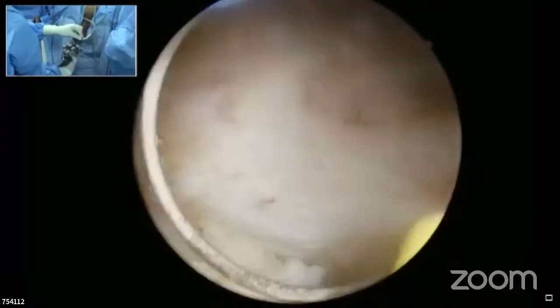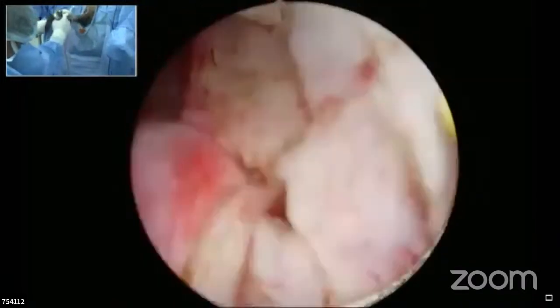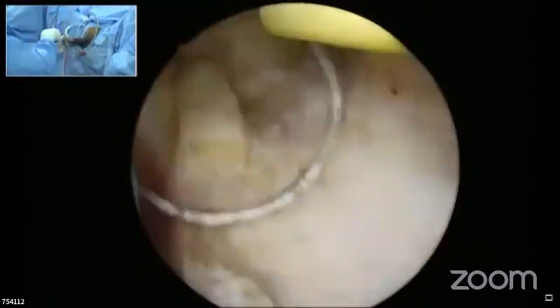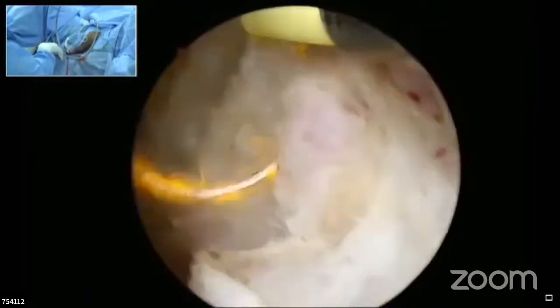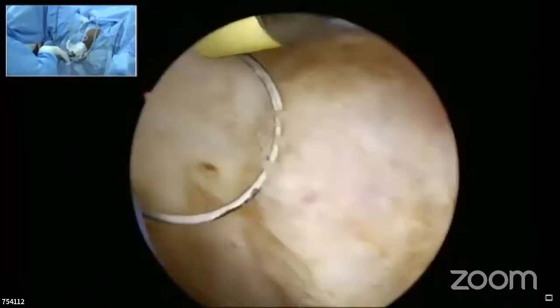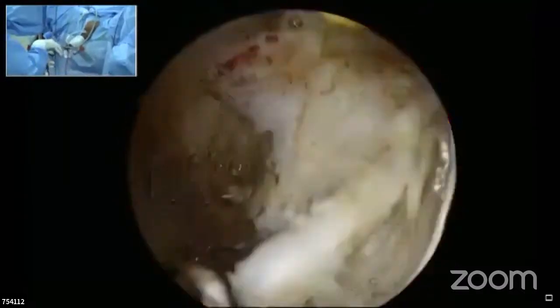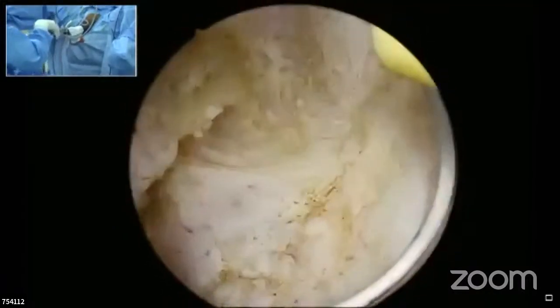Sir, the working dynamics of a passive element is actually anti-physiologic. Thumb movements of abduction and adduction are not physiological movements. So if someone is doing a lot of resection work, a lot of work with passive elements tends to create tendinitis of the abductor muscles of the thumb, sir. And tenosynovitis is one of the professional hazards of using a long-term passive working element, as compared to an active element, where the flexion movement of the fingers, which is the physiological movement, is the basis. So it is a lot more ergonomic as compared to a passive.